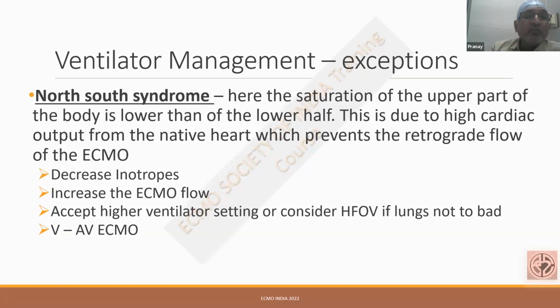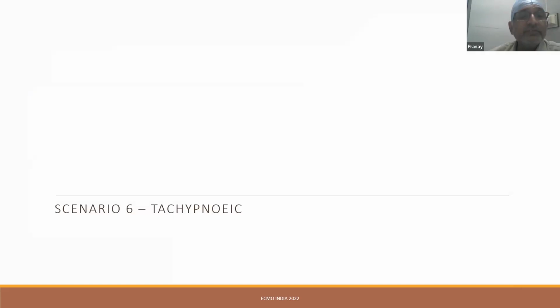This was already discussed in North-South syndrome or differential hypoxia. You might go higher on the ventilator settings, and we accept slightly higher ventilator settings to maintain good oxygenation with the native circulation.